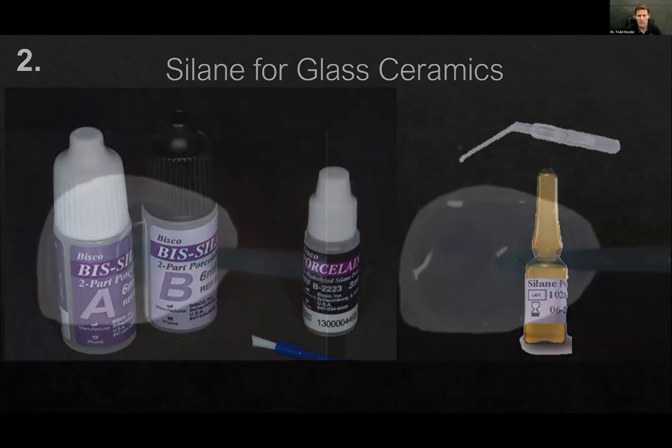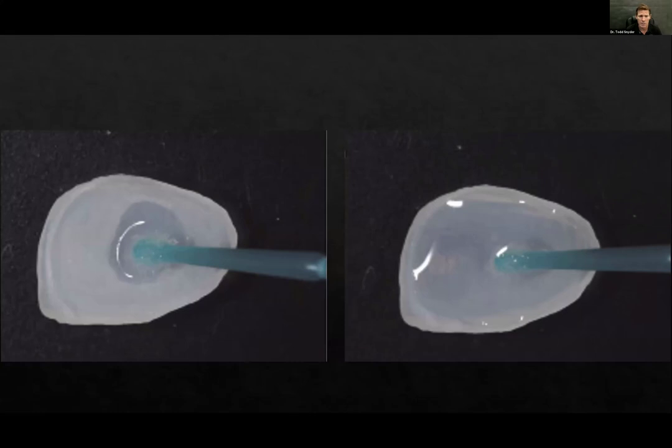So from there, if you picked a silane from whatever company you want to implement, you'll notice here I'm painting it on the inside. You'll see it's actually pooled on the right-hand side. Now, as far as pooling the material, you don't need this much. I'm just showing you that when you're putting this on, you're covering everything in its entirety. So again, you don't need to use this much, but I wanted you to see that it's covering everything. But you'll notice how the frostiness goes away, okay?